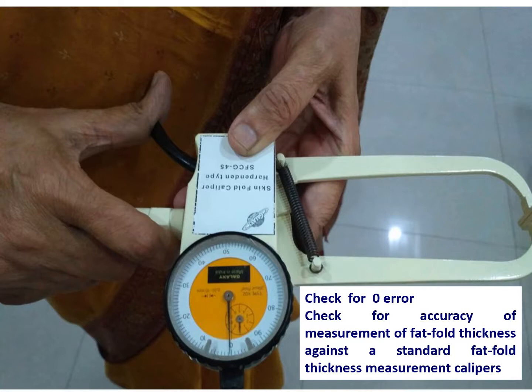The first thing that has to be checked before using the Harpenden caliper is to check for zero error. If there is no zero error, the instrument has to be checked for accuracy in measurement of fat fold thickness in a person who has normal fat and compared with the measurements done using a standard fat fold thickness measurement caliper.